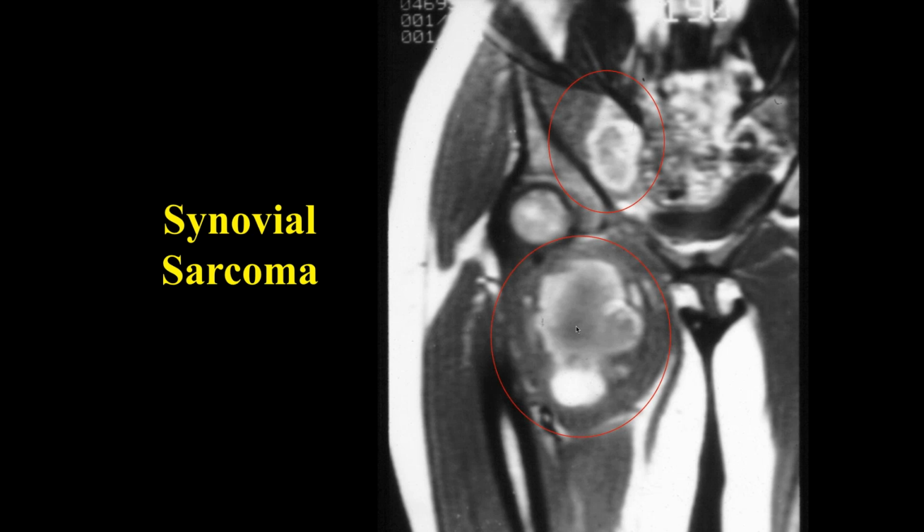And then also, I don't know if another metastatic lesion could cause that in the muscle, but it's unlikely. I guess it could. There are some vascular metastatic lesions that could have hemorrhage like this, but this is fairly typical of synovial sarcoma. Hopefully you pick up mets before they're this size. We'd like to pick up the synovial sarcoma before this size too.